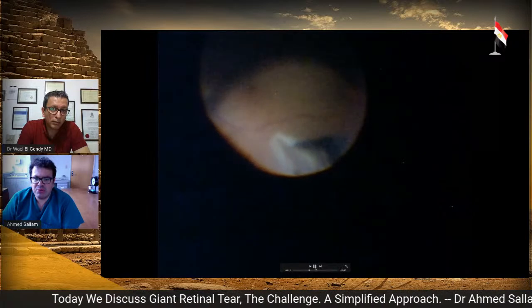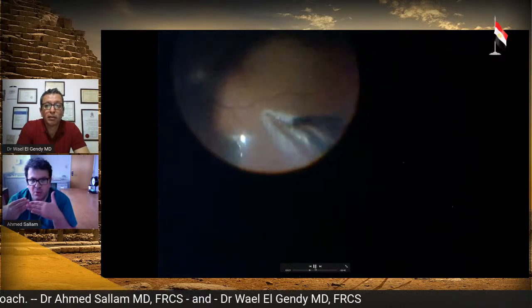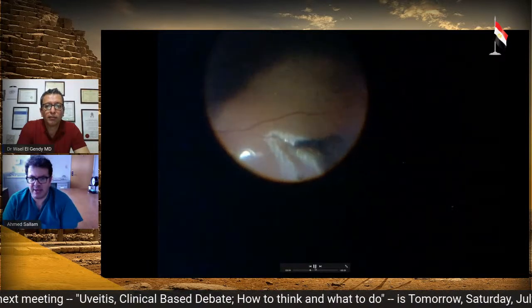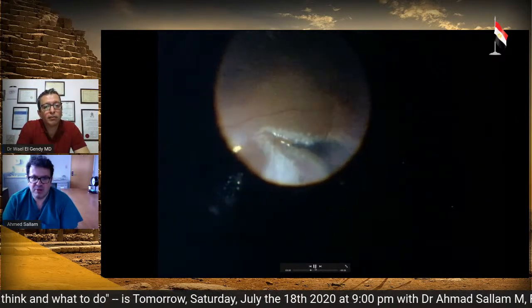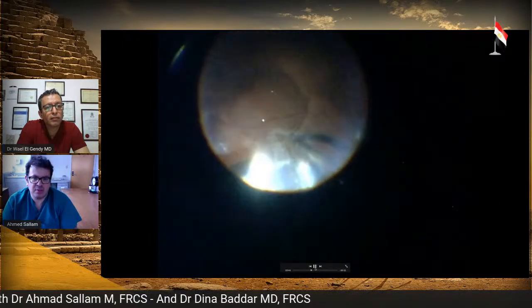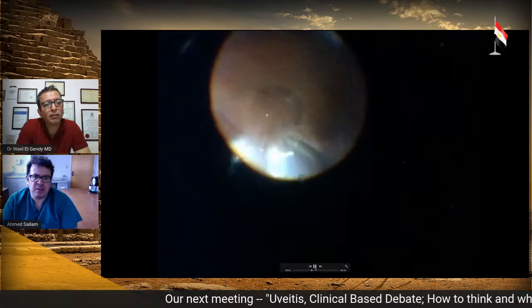And then you want really to just keep sucking. You're now in the BSS, PFCL, until you get the oil. Once you get the oil reaching to you, then you start moving with the bubble, and we'll see it now. So here it is, right? Now wait, and then I would just go with the bubble backwards. And that's the passive technique.